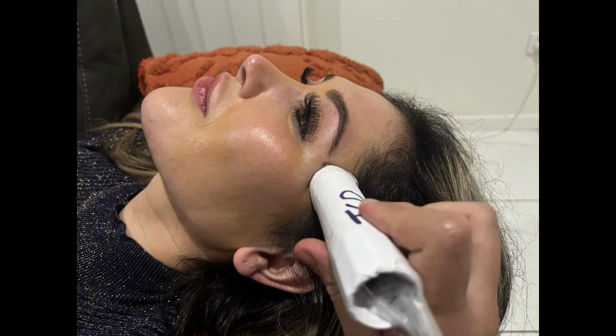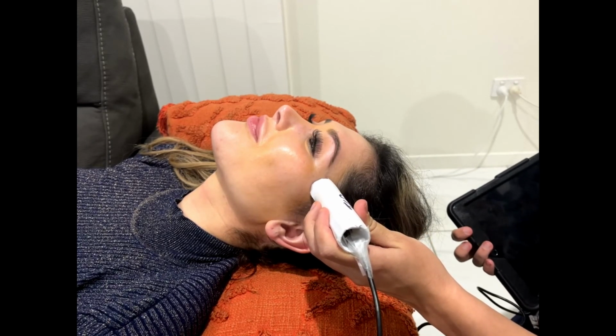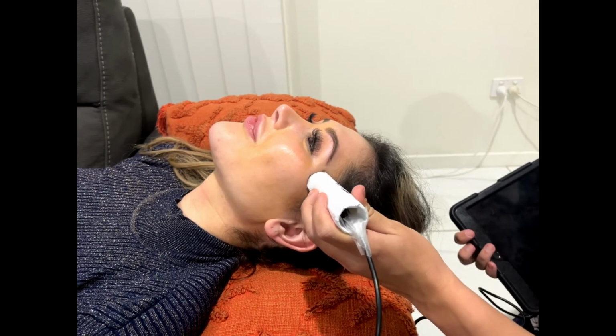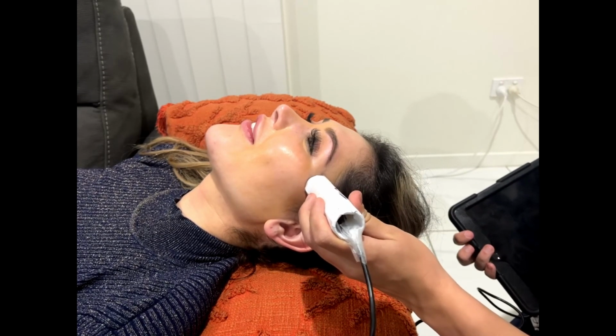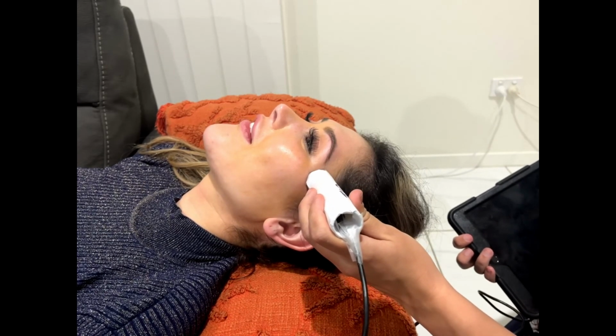There are 3 windows of cranial access, however, the temporal window provides the best view. The Doppler probe should be placed at the patient's temples with a small amount of gel. The Doppler should be positioned to direct the ultrasound waves towards the blood vessels being examined. Using a 2 MHz pulse wave Doppler probe, waves are emitted from the probe, which is reflected by the flowing red blood cells back to the receiver.